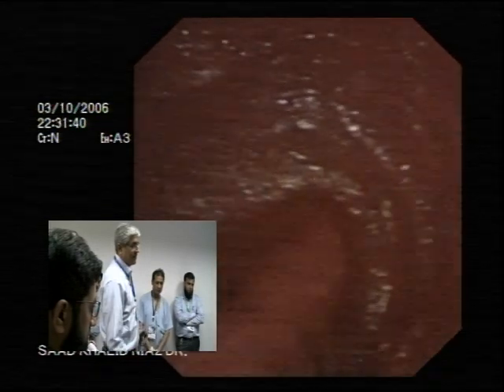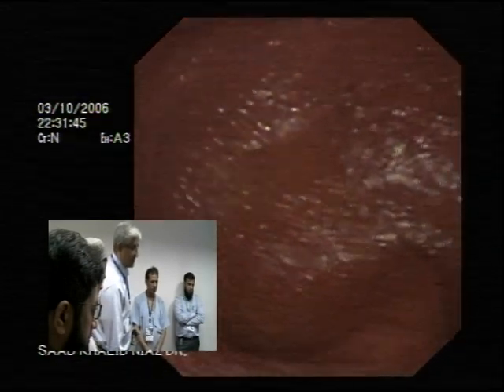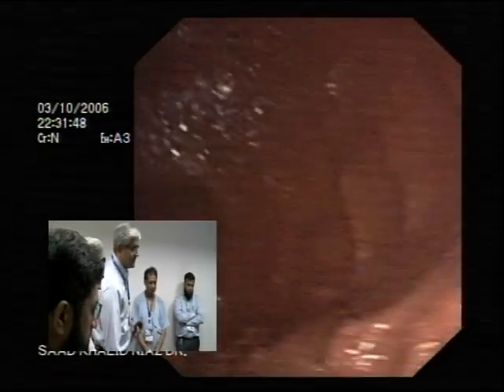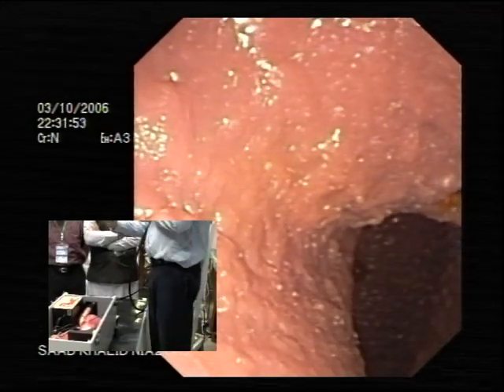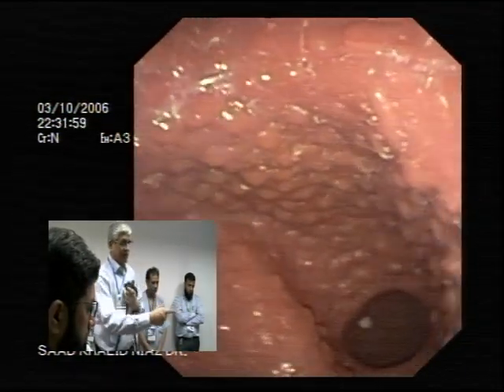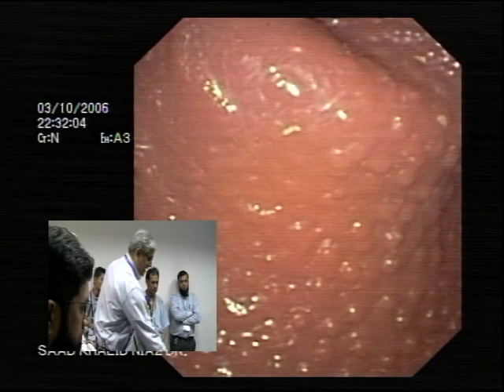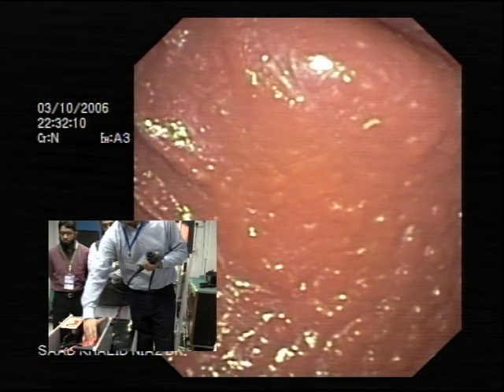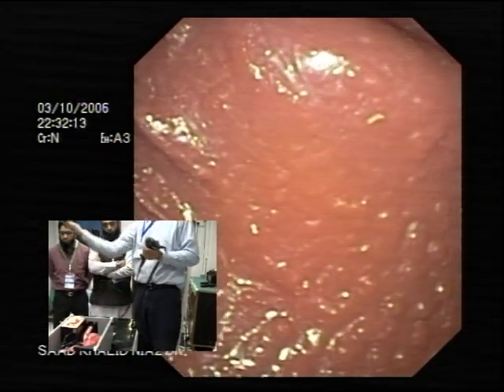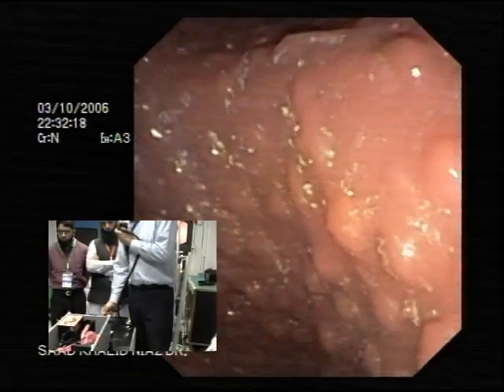So one of the ways to do it is you just go anti-clock when you're here. We'll show you better later. After the anti-clock, you turn, and even in this we've now got big wheel up, and we'll keep moving in and we should see the pylorus there. So what we've done is we came here and did anti-clock. When you do clockwise, you literally have yourself in the antrum. With a little bit of big wheel, you should be able to see the pylorus, and we have.